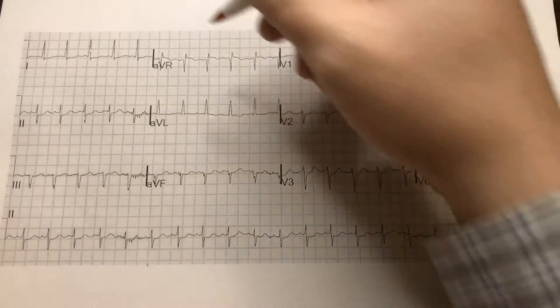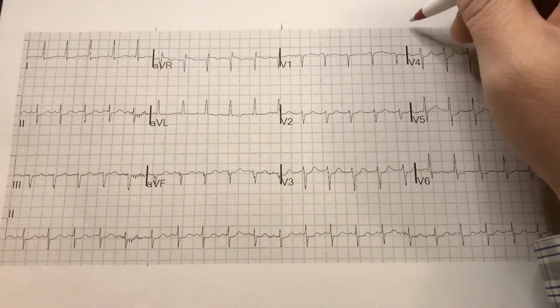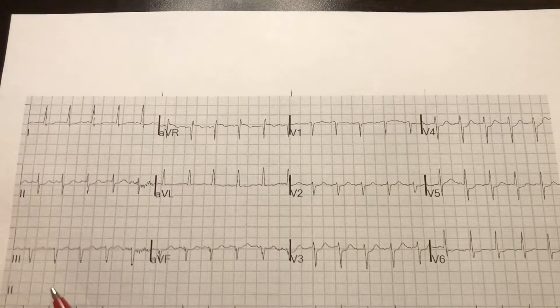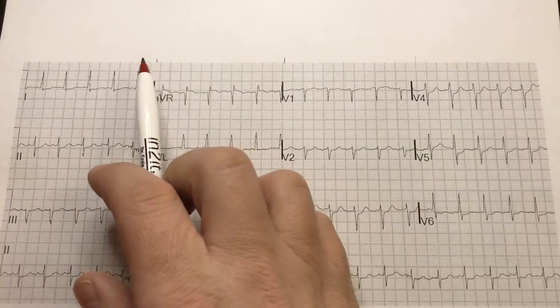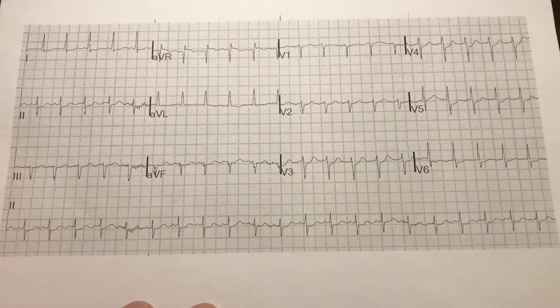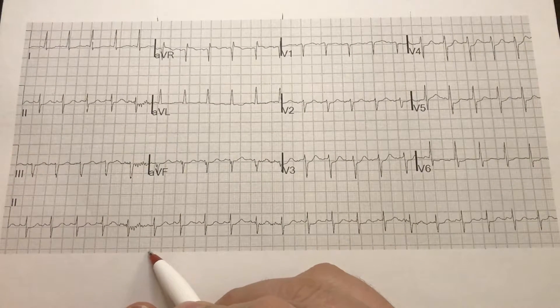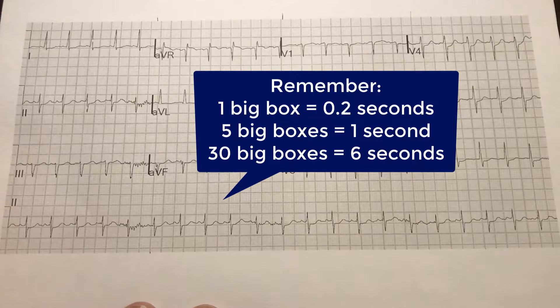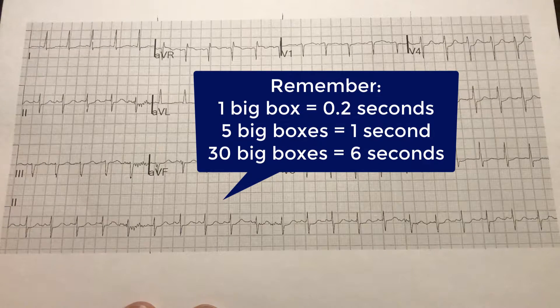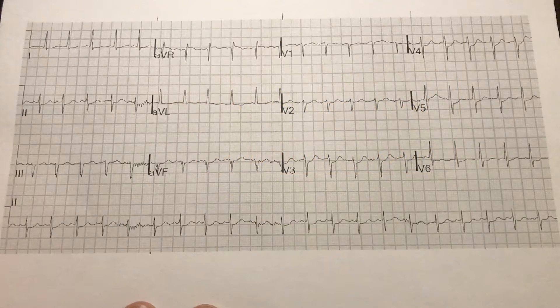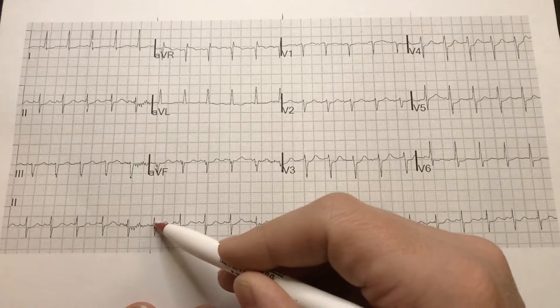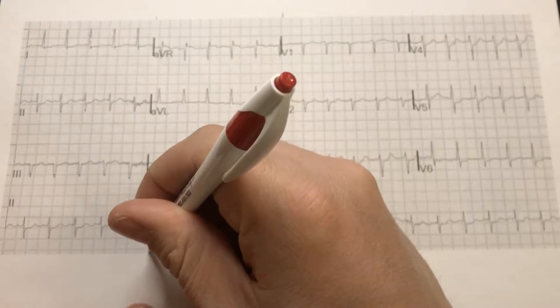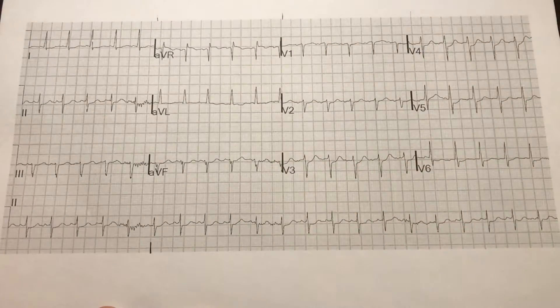Some machines are going to mark little tick marks across the top, marking at three seconds, so you can quickly identify six seconds. But most of the time you may want to count it out. One big box, or five millimeters, is 0.2 seconds, which means five big boxes equal one second, and 30 big boxes equal six seconds. I usually try to find an area where there's a QRS complex and start counting on that dark line — so in this case, here is zero and I'm going to count out 30 boxes.